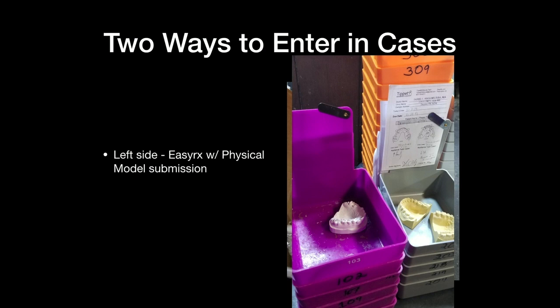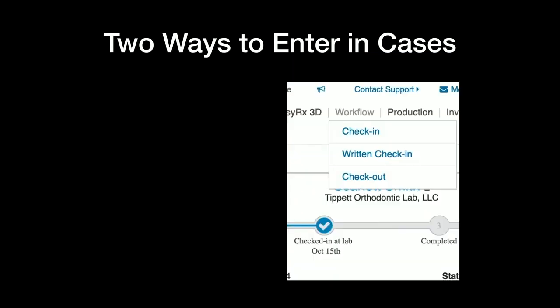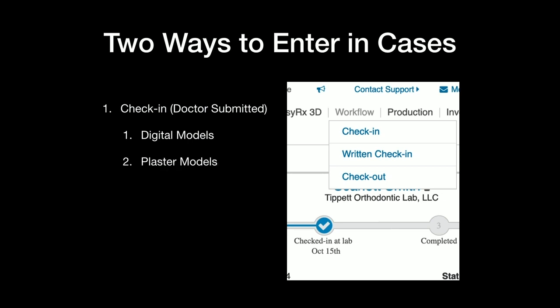Now, over here is the classic way, a script and models. EasyRx, you enter them both ways. At the menu bar, you have workflow, and you have check-in and written check-in. Check-in are the ones the doctors send you digitally, and written check-in are the classic paper script model. The check-in the doctor submitted is for digital models and plaster models. You see how they're going parallel. They didn't say, we're going to go all digital and screw the rest of you that do analog. It's like, hey, we got a method for both ways. You can provide for your doctors either way.